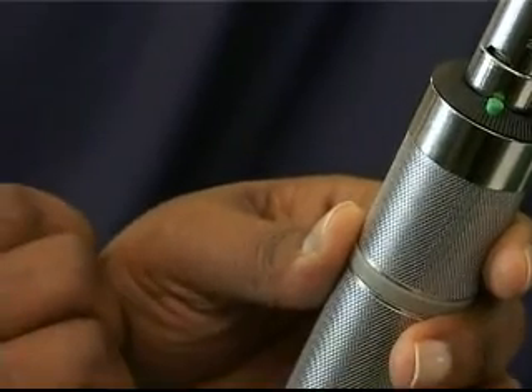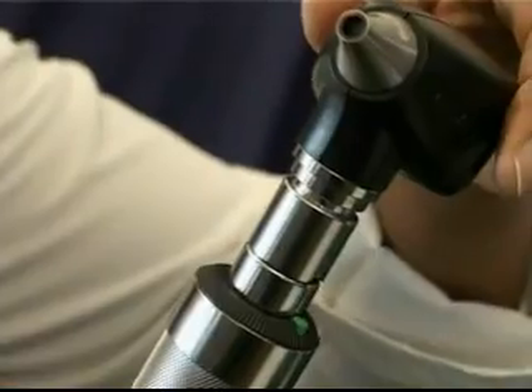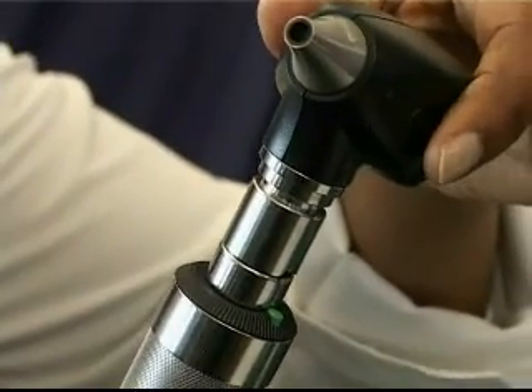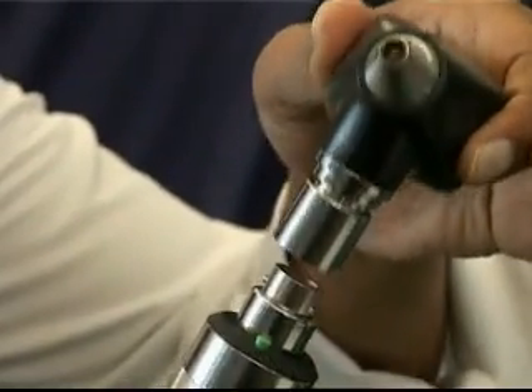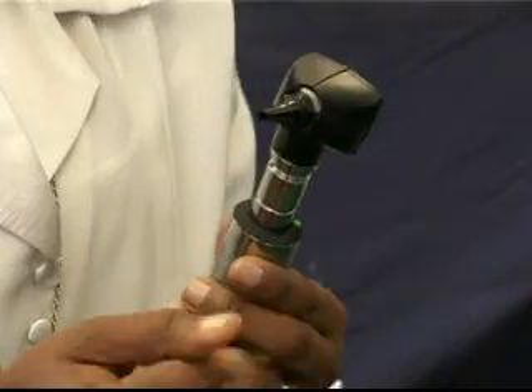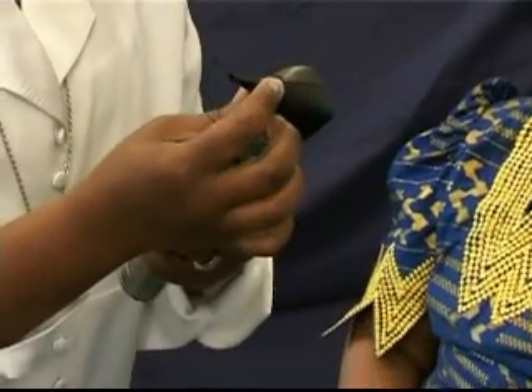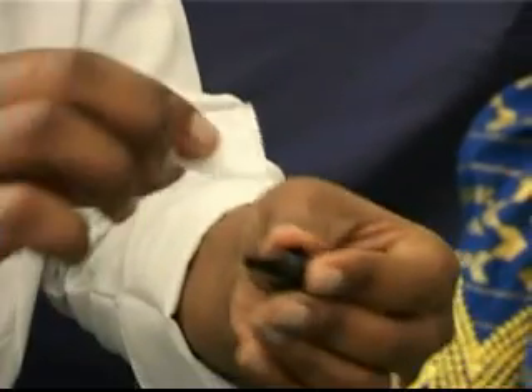Switch the power handle off by rotating the rheostat towards you. Remove the otoscope head from the power handle with a downward push and gentle twist to the left. On completion of the examination, the speculum should be removed from the otoscope head and any serum removed with a tissue or cotton bud.